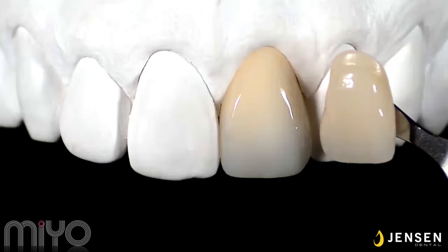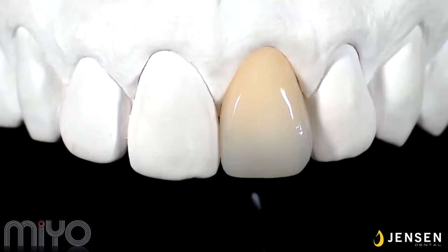Now the real fun starts. Slightly intensify the mesial and the distal corners to mimic the transparent effect of a natural tooth. Mamelon coral is applied, starting with the mesial lobe. As you can see, I'm constantly avoiding any kind of brush strokes. Float your colors on top.